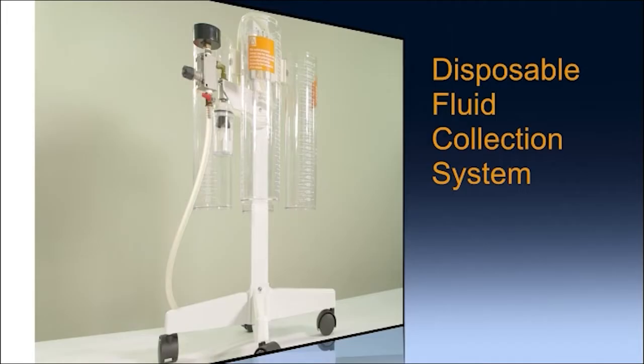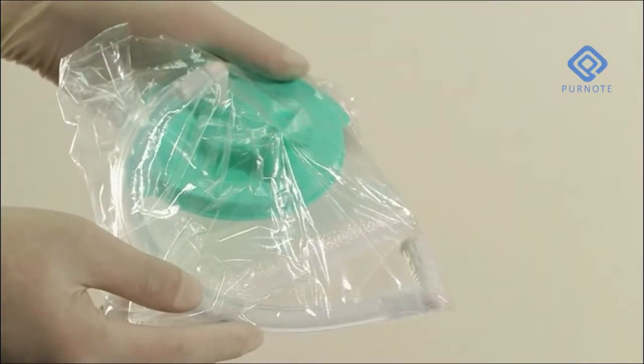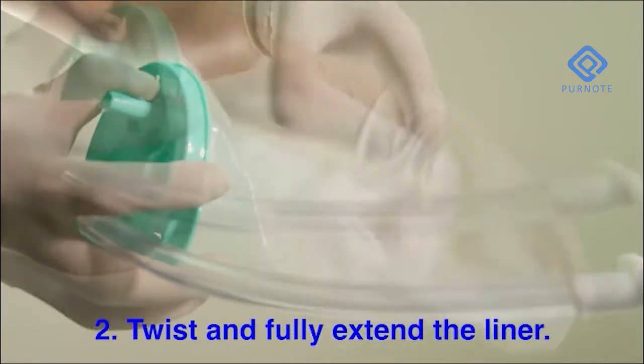Disposable Flow Connection System. Remove from packaging. Twist and fully extend the liner.